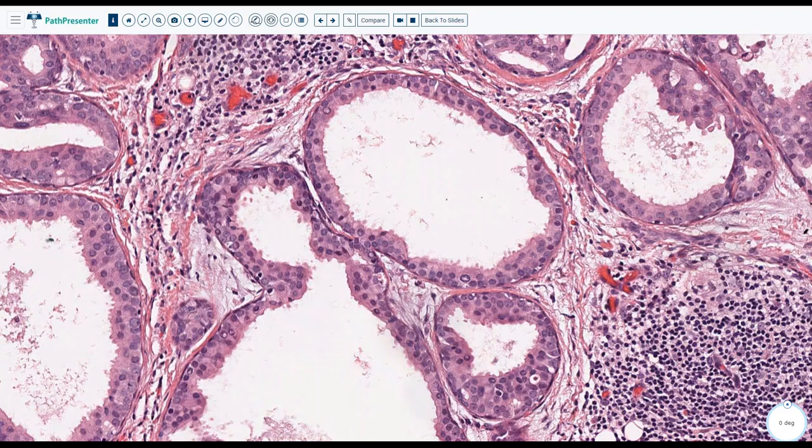Again, I'm talking about the oncologist because he or she would like to treat the patient. He is looking for something to give the prognosis and treatment modality. Even here, the treatment modality would be great for this immune stain, and that immune stain is HER2/neu. Okay, you can do HER2/neu. It is not that much of an impact because these are really aggressive tumors, but they will ask you for AR and HER2/neu stains.